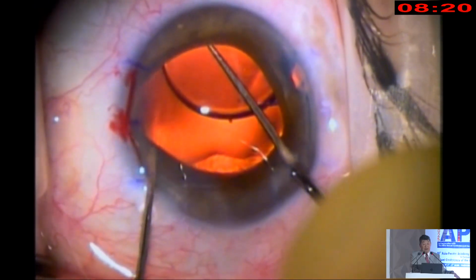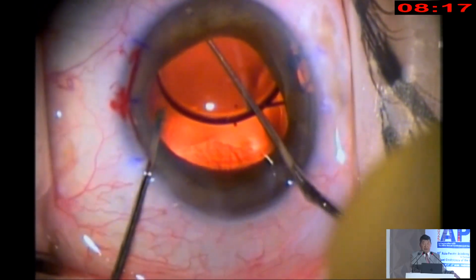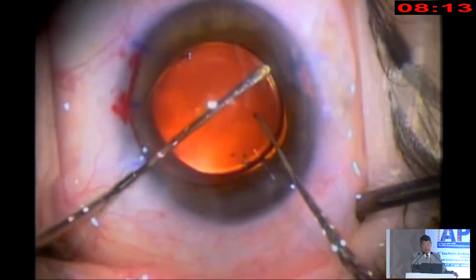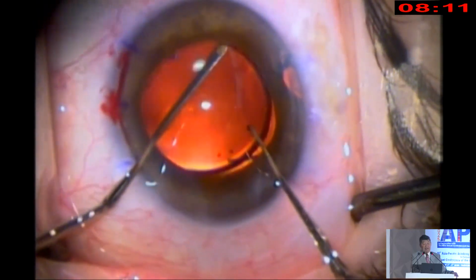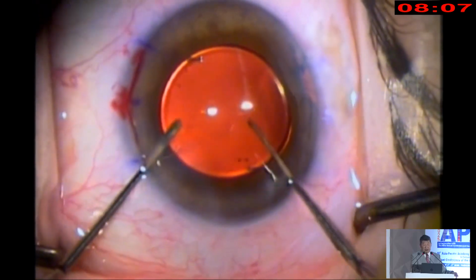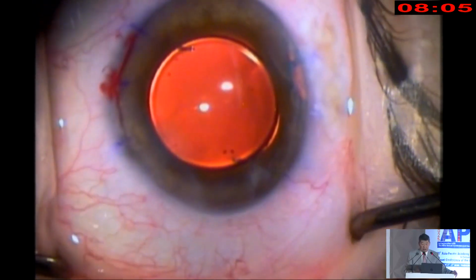And now I'm going to dial this one in, and this displacement of the IOL tells me I'm in the sulcus, because with a bag I wouldn't be able to do that. And so I've moved it. It kind of looks the same, but I have moved the location, all right? So what next? Someone suture it? All right, someone's doing this.